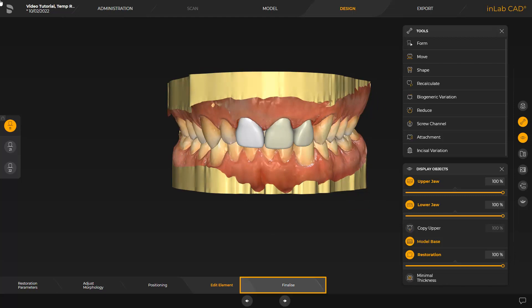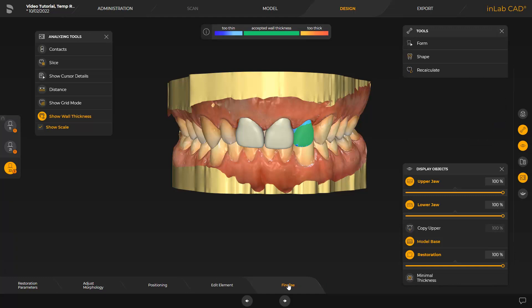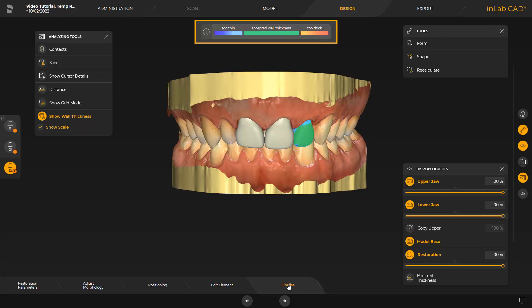Last, we switch to the Finalize step. Before exporting the temporary crowns, we first use the analyzing tools to check the design for adherence to minimal and maximal wall thickness. At the top of the screen is a color scale which serves the purpose of allocation and assessment. Areas marked in green are considered ideal — they completely correspond to the material parameters. Areas marked in blue are too thin and susceptible to breakage. Areas marked in orange or red are too thick, and there is a possibility that the print material will not be properly light cured during the print process. This can cause liquid print resin to remain on the restoration and thus cause potential health hazards. The analyzing tools will inform you of certain risks early on so that they can already be corrected during the design.